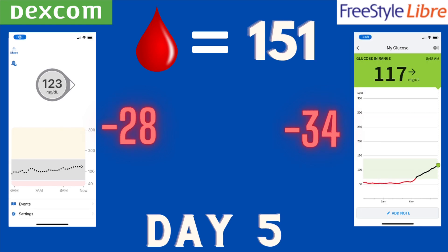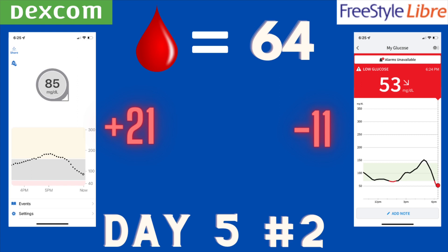Day five — I had a 151 finger stick. The Dexcom was showing 123 and the Libre was showing 117 — neither doing great, both off by nearly 30 points, though Dexcom was slightly more accurate. Later that day I started going low at a 64 finger stick. Dexcom had a diagonal down arrow, catching up but still 21 points behind. The Libre was already there at 53, only 11 points off — same pattern as before, Libre more accurate during lows.